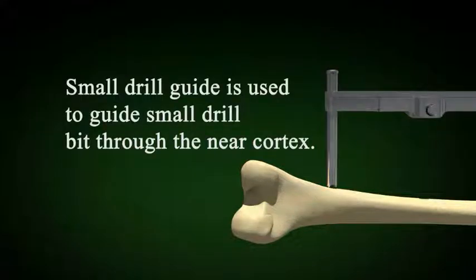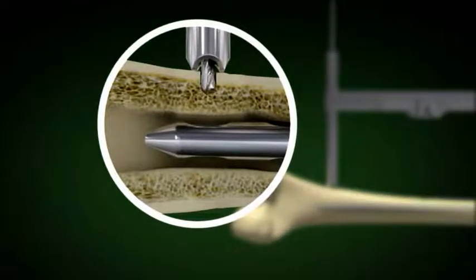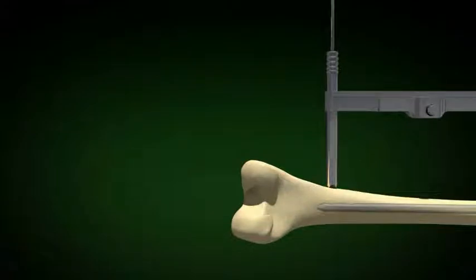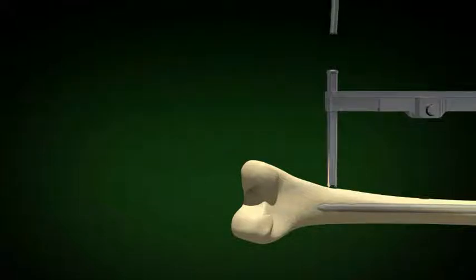The small drill guide is placed through the cannula and the pilot hole is driven through one cortex, the near cortex. You can see on this video placement of the drill bit. The hole is then enlarged using the step drill and the large drill guide. Note the step drill as it proceeds through the cortex.